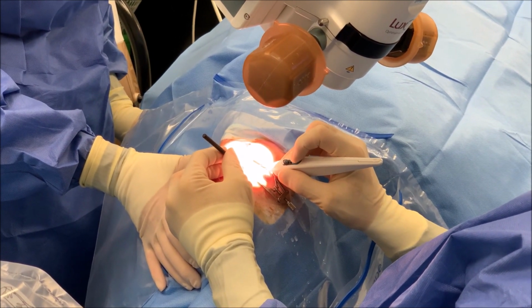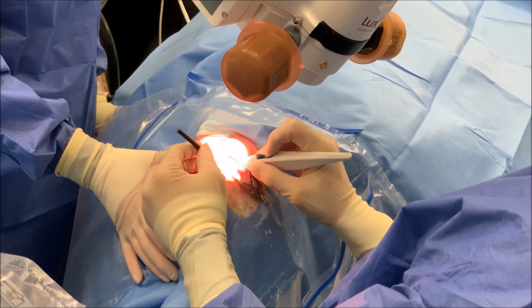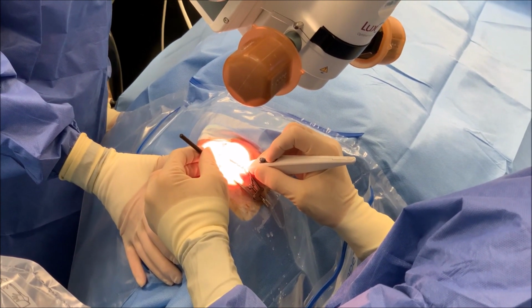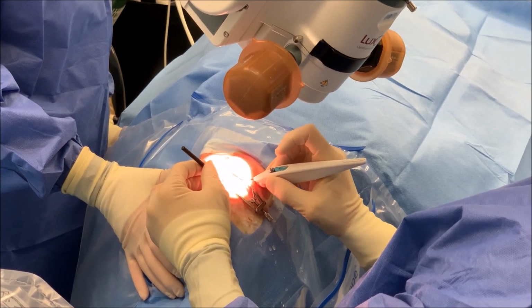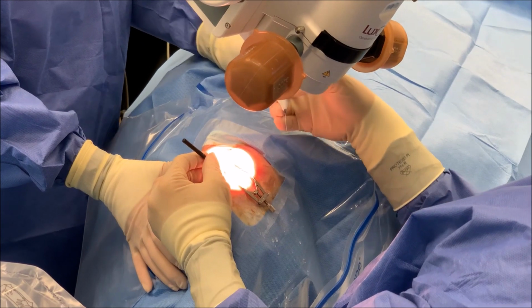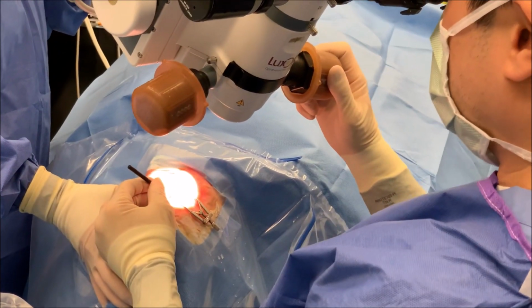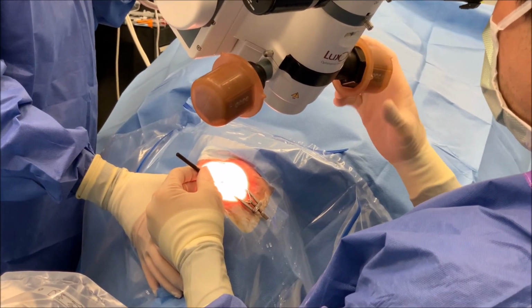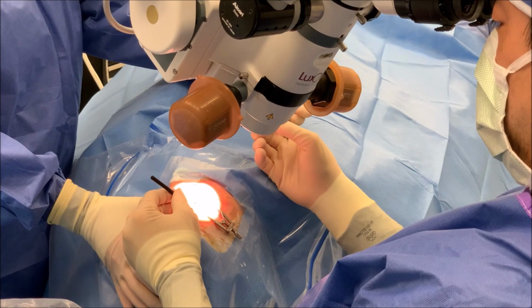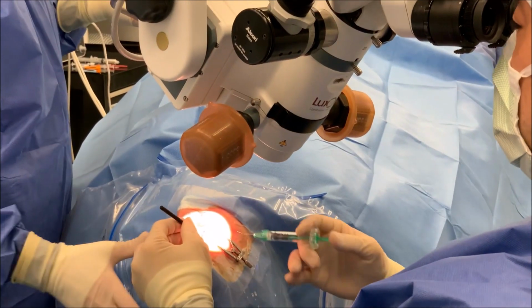And then again here, I'm trying to move. You see me trying to shimmy my chair and move my hands a little bit. It's a little bit tricky to do it that way without coming out. So I go ahead and push the sleeve down, come out. I rotate the microscope, rotating it clockwise so it points towards the right, and I shimmy my chair over towards the left. So I put some more cohesive viscoelastic and then go back in with the device.